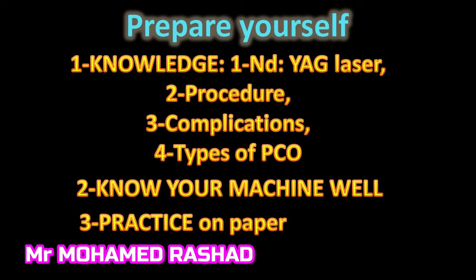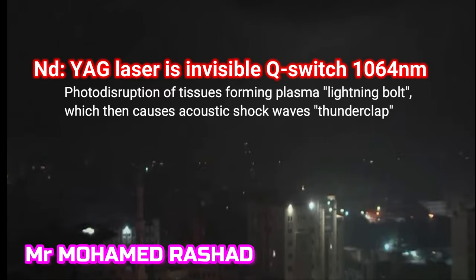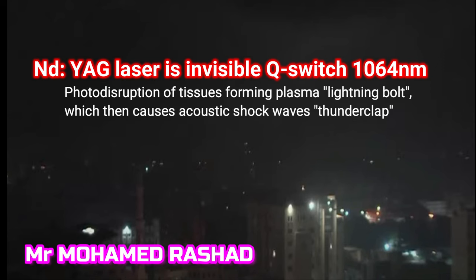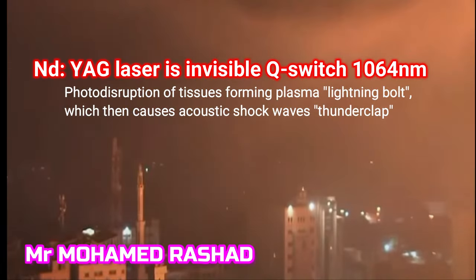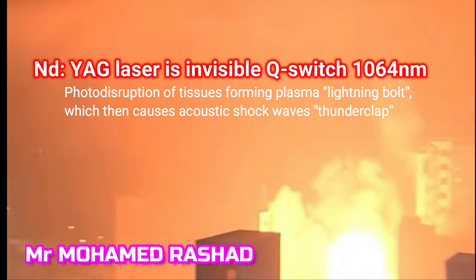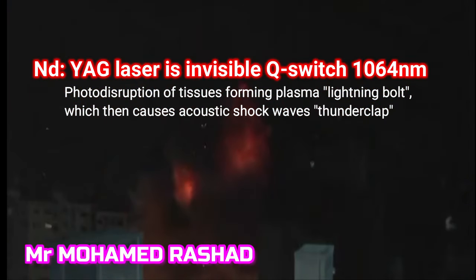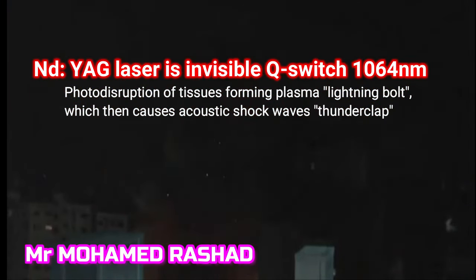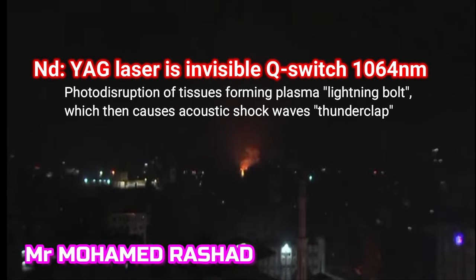YAG laser is an invisible laser with a wavelength of 1064 nanometers, doing photo disruption of tissues, forming plasma and causing acoustic shock waves, doing a hole in tissues.